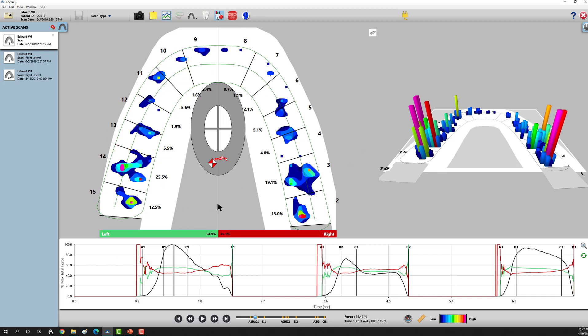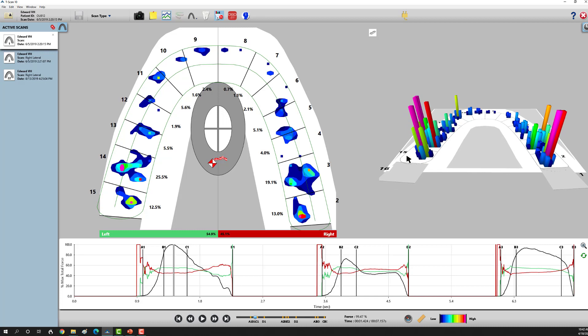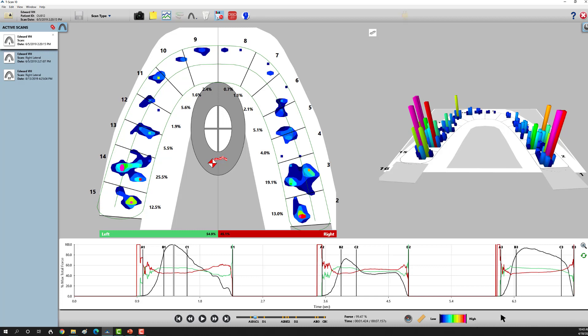This is probably the most intuitive portion of T-Scan data for dentists. This is a 3D version of the same 2D rendering over here. The height of the pixels tells us something about force, as do the colors. Low is down here in the blue, high is in the orange to red, and pink is so high the machine can't read the data.